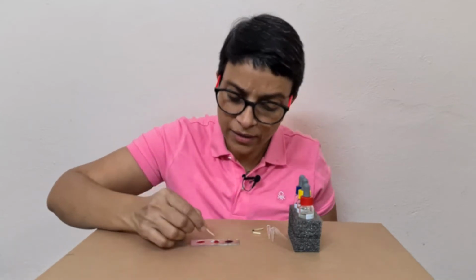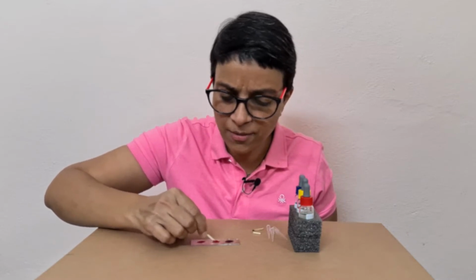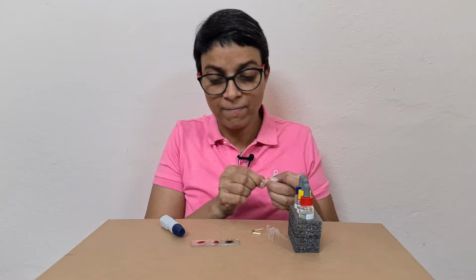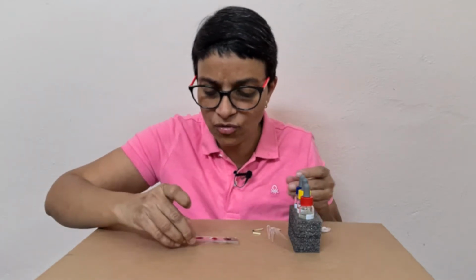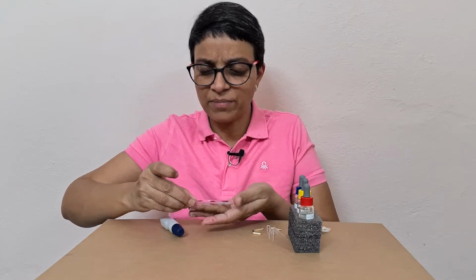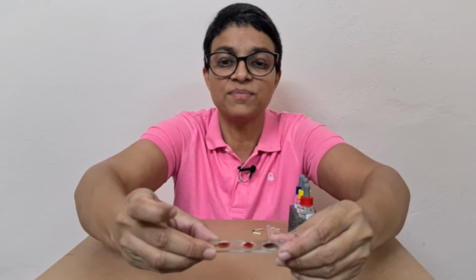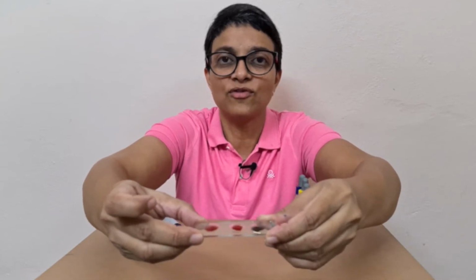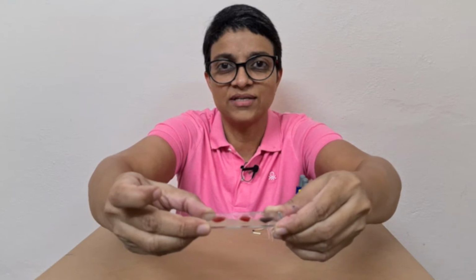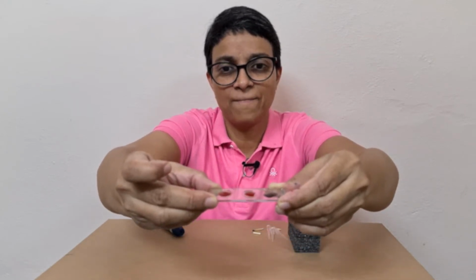Now I can show you that I'm B positive because the clumping has occurred with B and D. We can paste a photograph of this. You can see the clumping in the RH one very much visibly. I don't know if you're able to see this. I'll take a picture of this and put it at the end of the experiment for you to see.